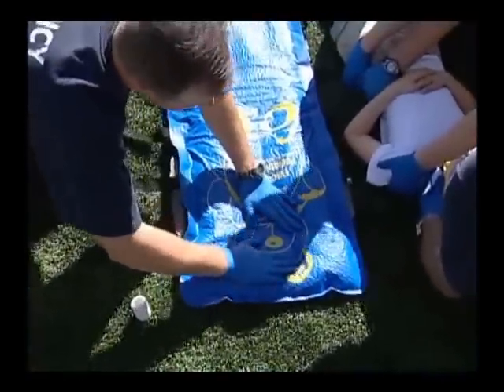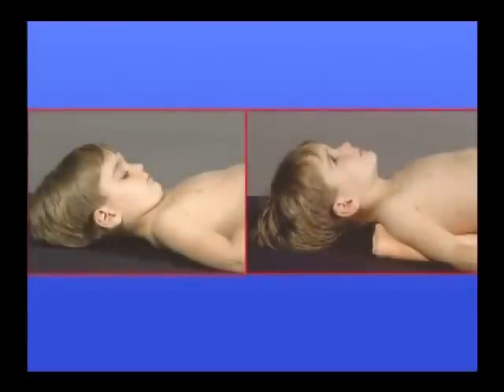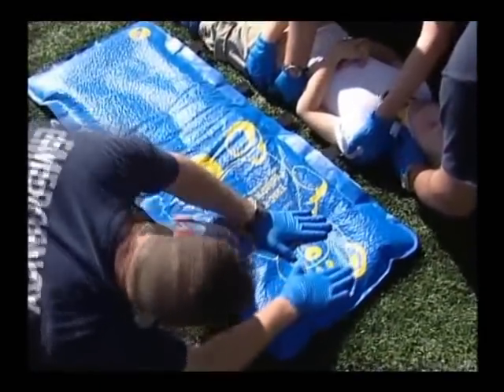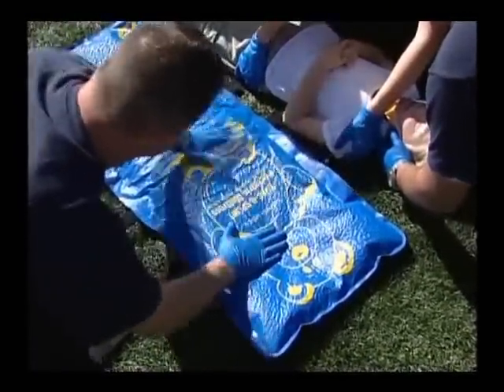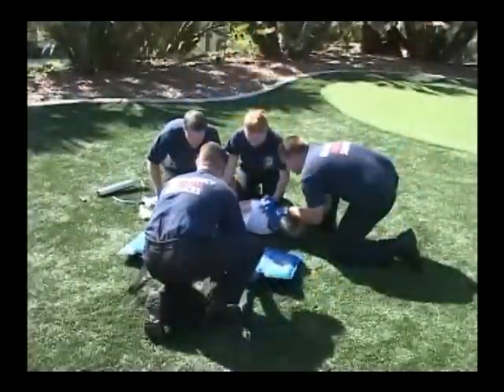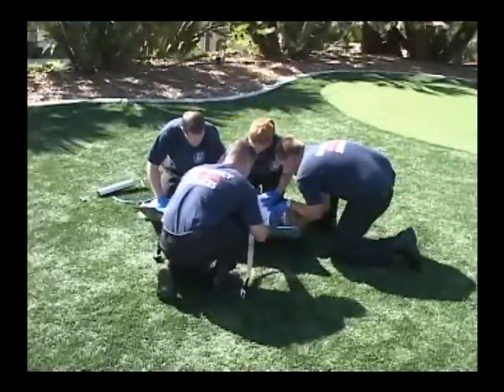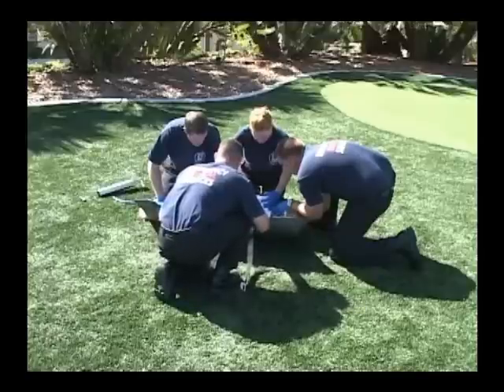Because of the anatomical differences between adults and children, the child's torso usually needs to be elevated so that their cervical spine remains in neutral alignment. If the patient's head is flexed, simply make a slight depression under the occipital region of the child's head. The amount of depression can easily be changed depending on the size of the child's head in relation to their body. This helps place the child in neutral alignment and does not require the child to be repositioned once they are placed on the surface of the pediatric mattress.